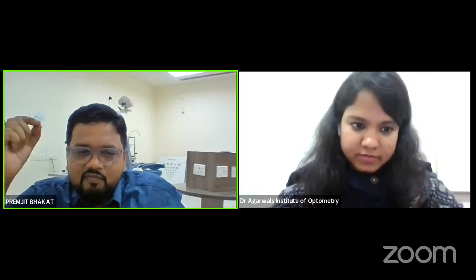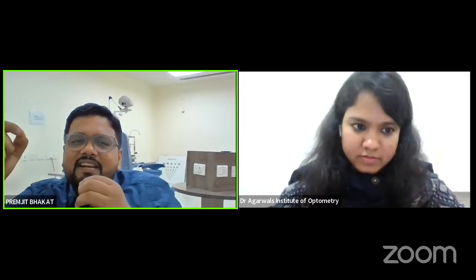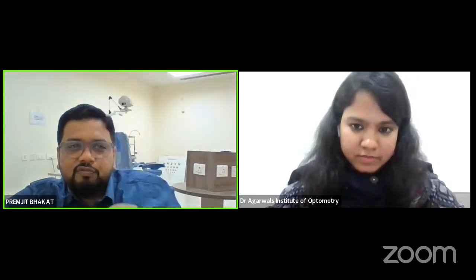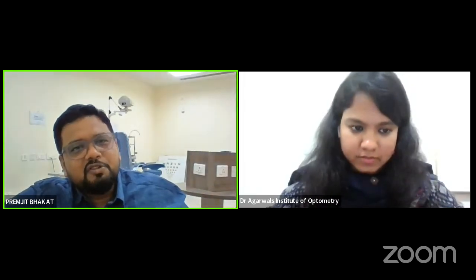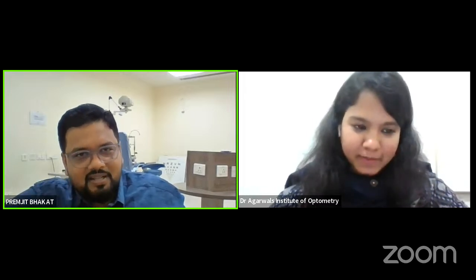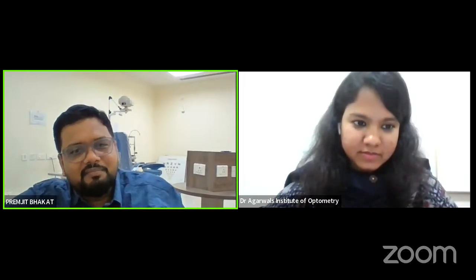Now, what happens is if one lens fits a little tighter, the next lens will be a little different. Maybe the thickness may change, the total diameter may change, the base curve may change. So you will have an understanding that if I move from this lens, probably that lens will give me a better fit. That is why it is for your learning. But as you said, you get ready-made lenses, but to understand if the fit is good or bad, you must have the K readings.